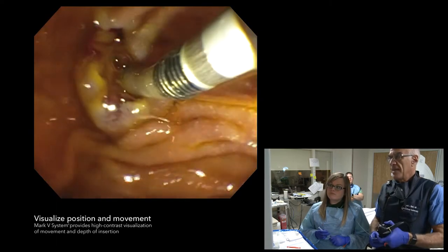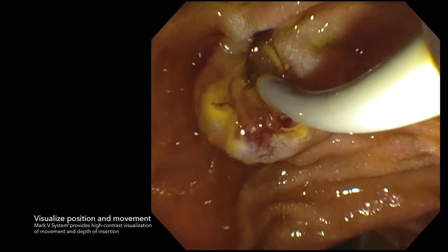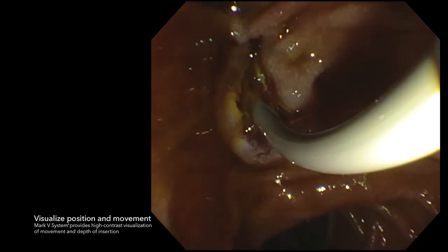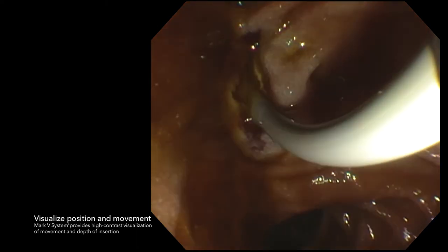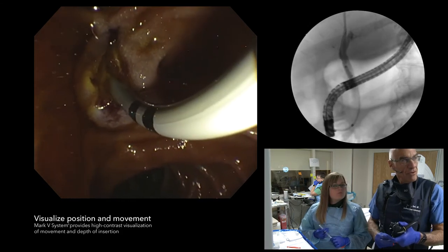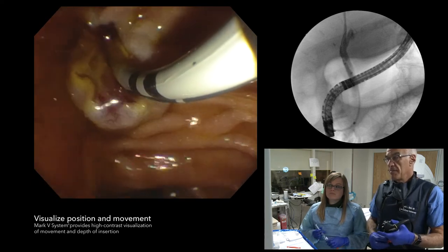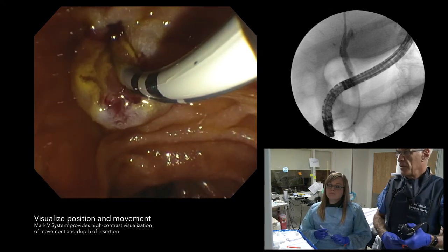There's a nice feature of a lot of the Cook catheters I like to show — it's the strictly measuring functionality. There's one black line, then a metal band, two black, three black. Three black is 15mm, two black is 10mm, one black is 5mm. So for example, if I wanted to place a biliary stent with the end right at the top of that balloon near the bifurcation, you can see I would take a 10mm stent. Very useful measuring functionality. The guide wire also has measuring function, and it's present on the tome, the balloon, and a lot of the catheters.